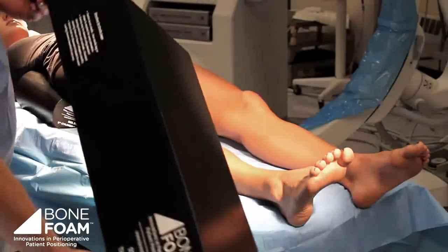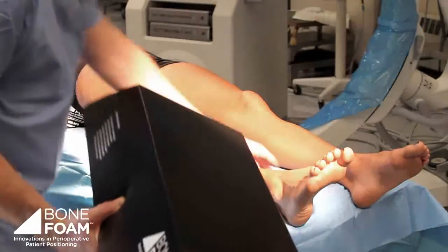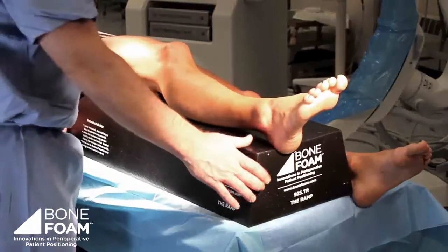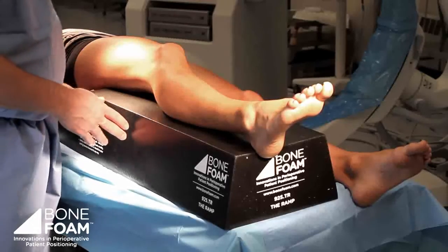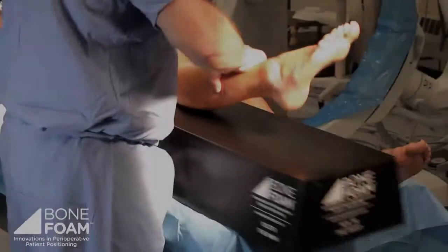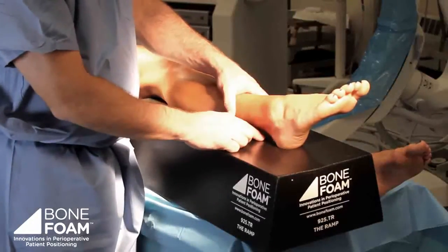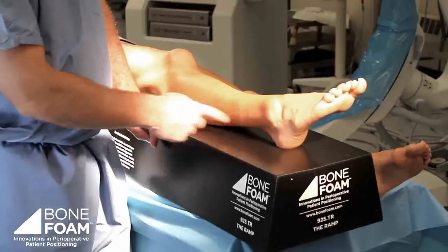This is the bone foam ramp, which we simply position under the leg like so, and this angle accommodates the buttock. This elevates the leg that the surgeon is operating on and takes the other leg out of the field for C-arm imaging. I would use this for ankle procedures and perhaps plating procedures of the tibia and of the fibula.